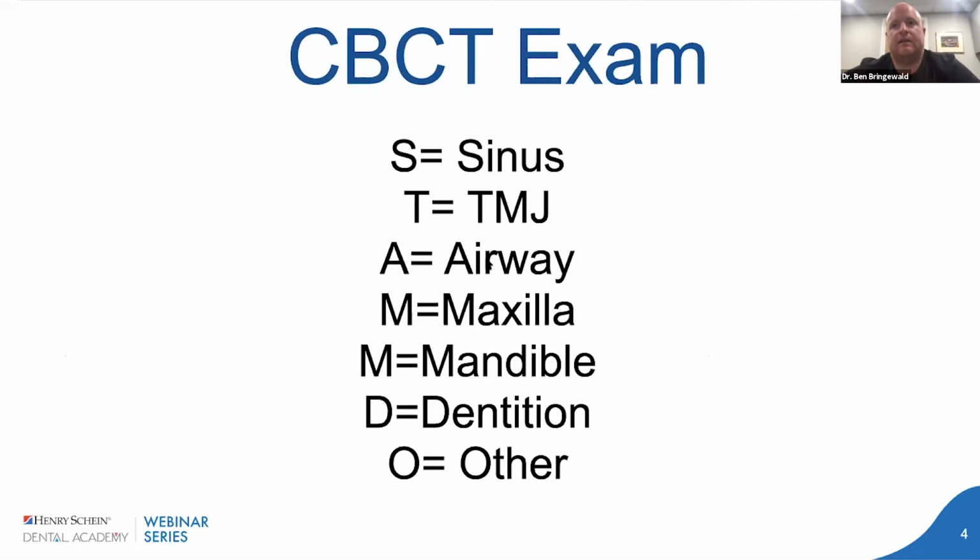One of the things that was kind of daunting for us initially when we got our CBCT was just the sheer volume of information that we were able to acquire with that. I think as dentists, we have gotten very used to very quickly reading 2D images like bitewings, like PAs, pano axis, and we can just glance at them, and we can see anything that's amiss there, just because we have seen so many normals, especially when it comes to panoramic X-rays.